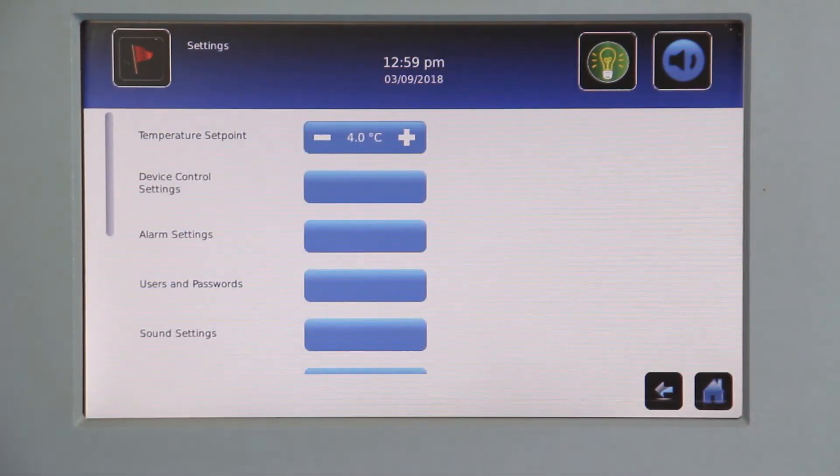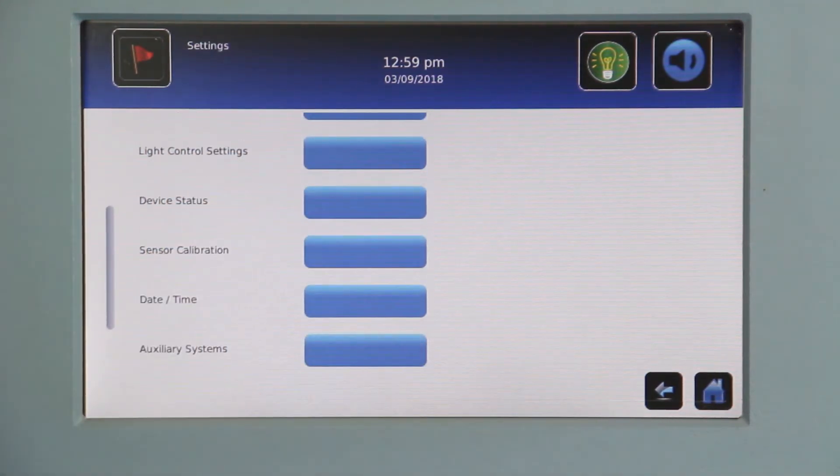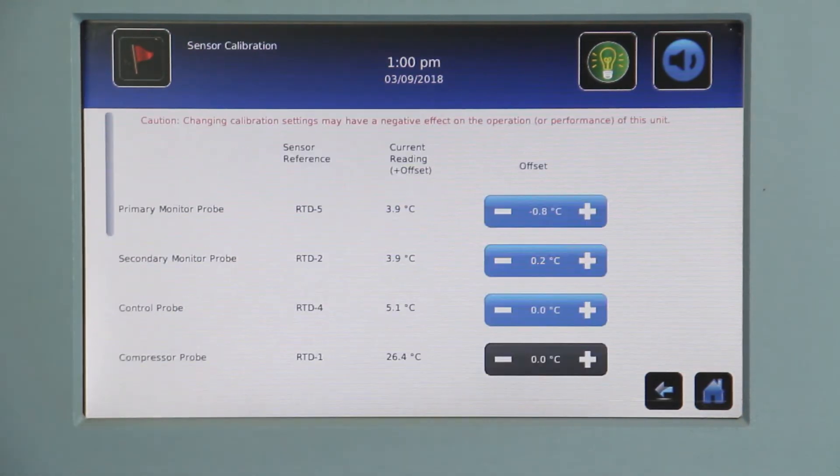Then find the temperature calibration or the sensor calibration button, depending on the version of software. If you are checking the temperature calibration of the probe bottle located in the top of the chamber, you would be looking for what is labeled as either the upper probe or primary probe temperature.